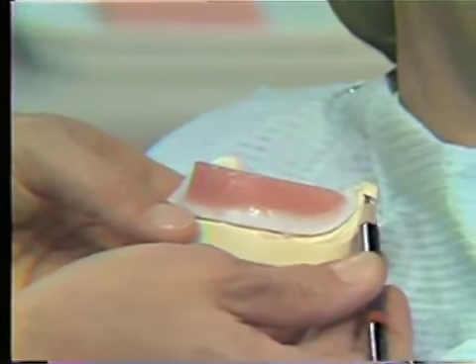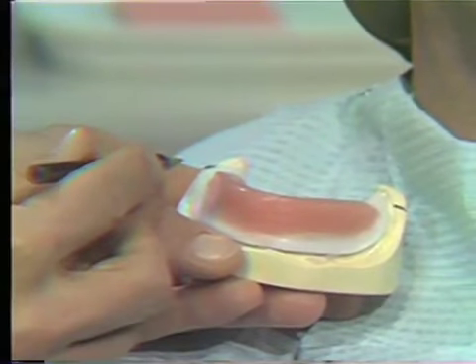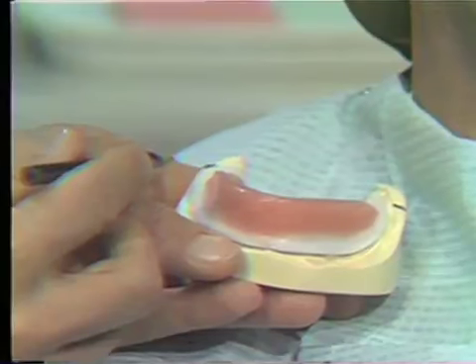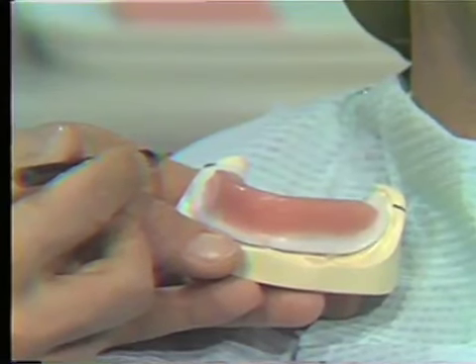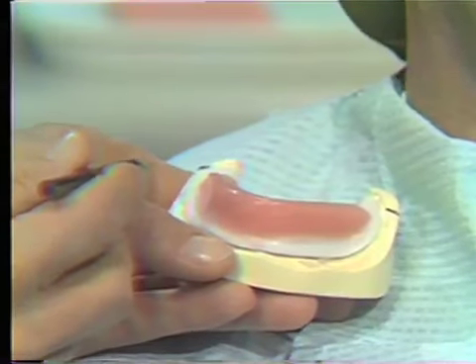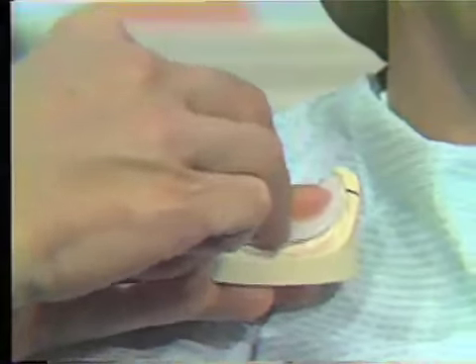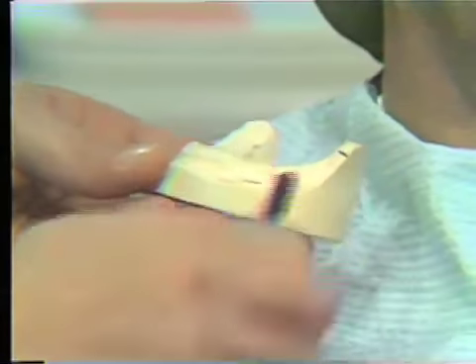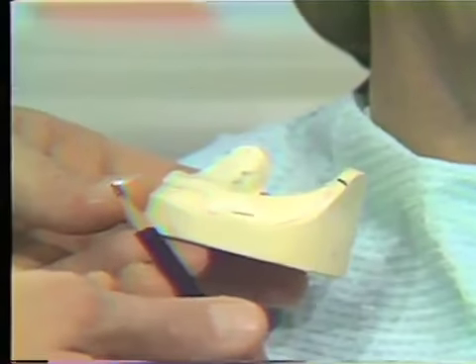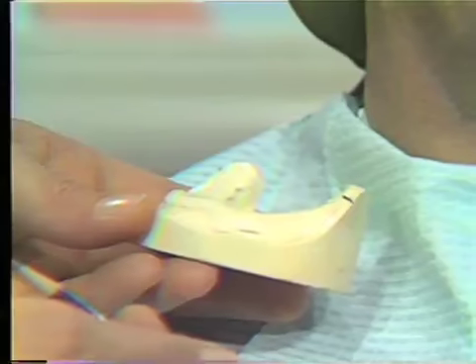specifications of being, if extended posteriorly, would hit a point. And here on the cast you see the two lines. These are representing a point on either side, 1 to 2 millimeters below the top of the retromolar pad. Our other requirement for our plane of occlusion is that it be parallel with the mean of the lower residual ridge. And if you'll note, the lower residual ridge, we've tried to parallel this. Now this is a laboratory procedure. So far we have accomplished this totally in the laboratory.